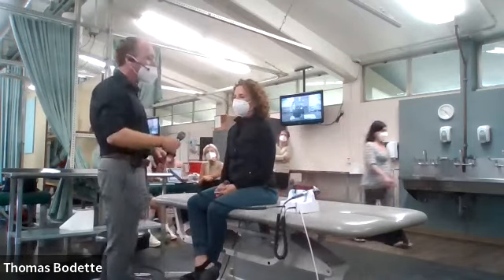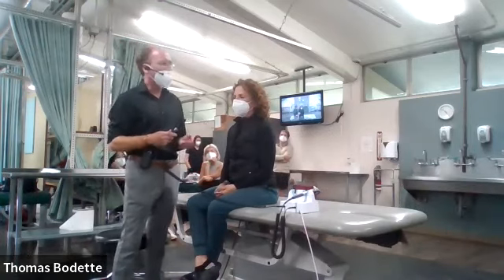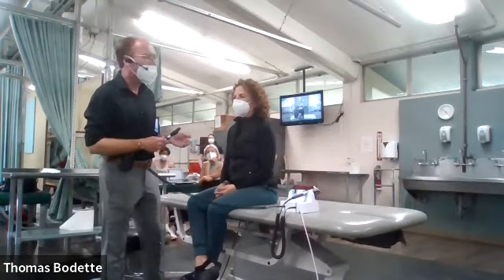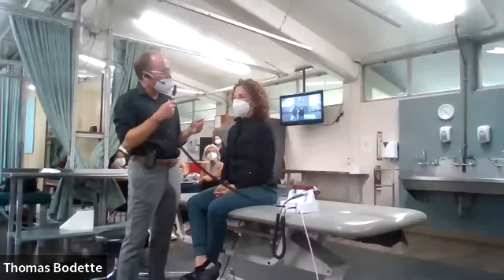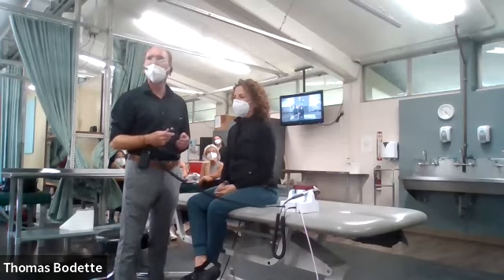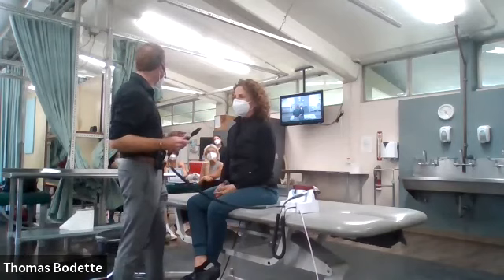So the very first thing you need to do is make sure that your light source works. You're wasting your time and the patient's if you look through the aperture and you say, oh yeah, there's a red reflex when the light source is not on. That's usually when I take out my driver's license to look and see if I was born yesterday.